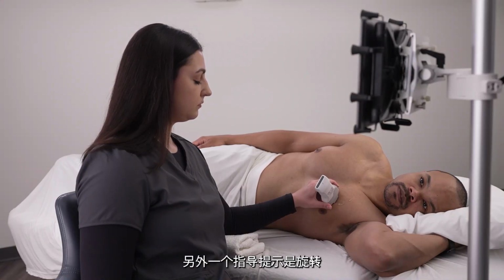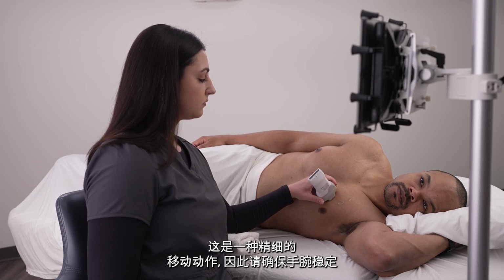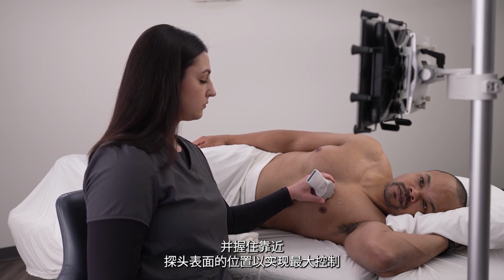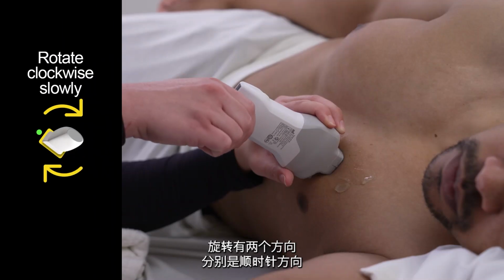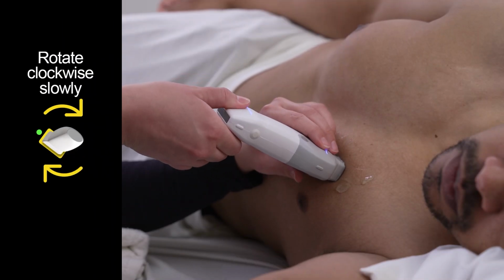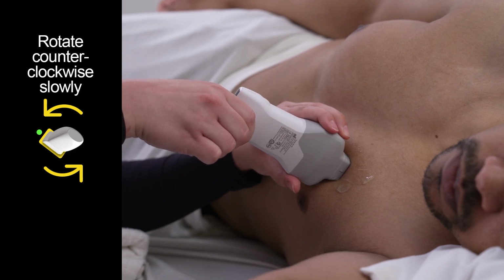Rotate is another guidance prompt. Since it is a fine movement, make sure to stabilize your wrist and hold the probe close to its face for maximum control. The 2 directions for rotating are clockwise, or to the right, and counterclockwise, to the left.